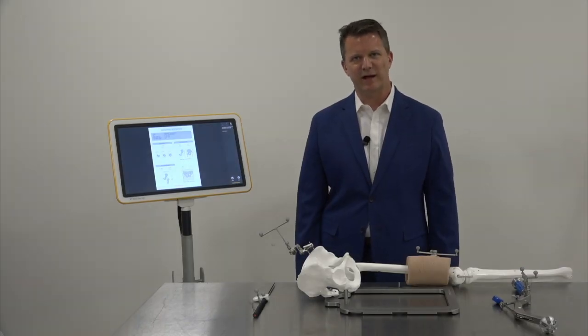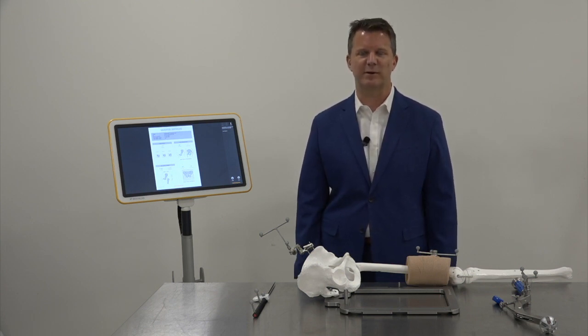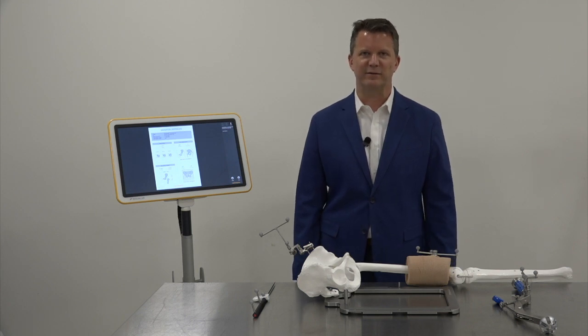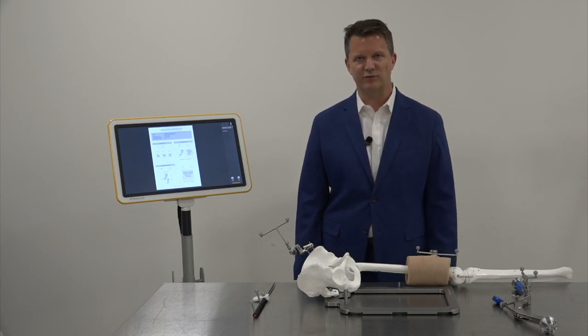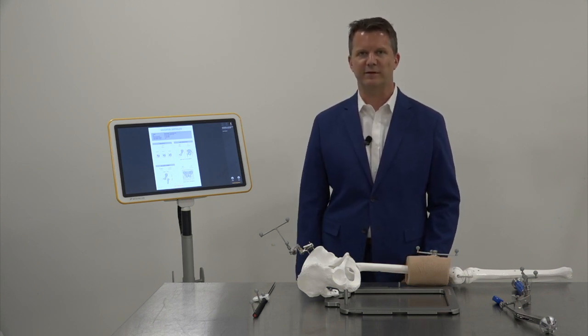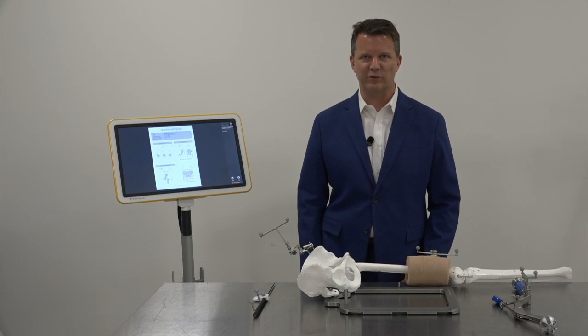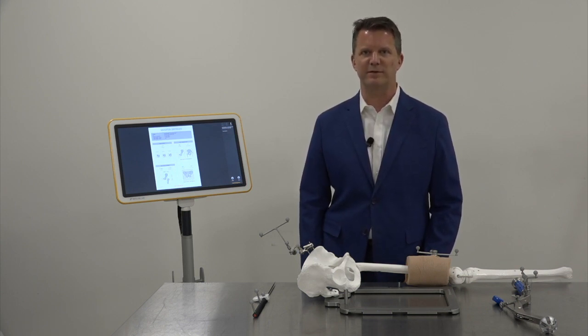Navigation in total hip arthroplasty has been shown to achieve more consistent leg length restoration as well as more accurate placement of the acetabular component. HIP7 was designed for efficiency, allowing the surgeon to take control of acetabular positioning, leg length and offset, and also to consider pelvic tilt for the placement of the components for that particular patient. It also includes the simulated post-op AP X-ray, which gives the surgeon qualitative information during the surgery to consider what that post-op AP film will look like.